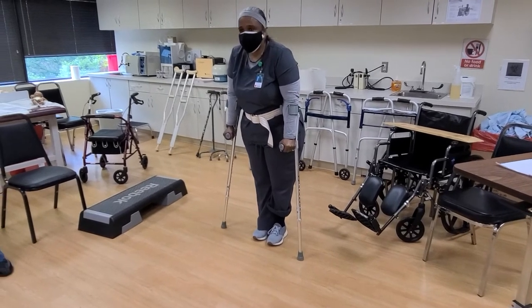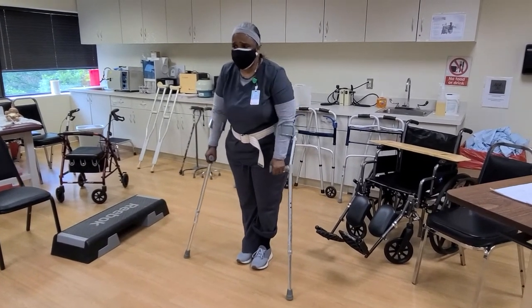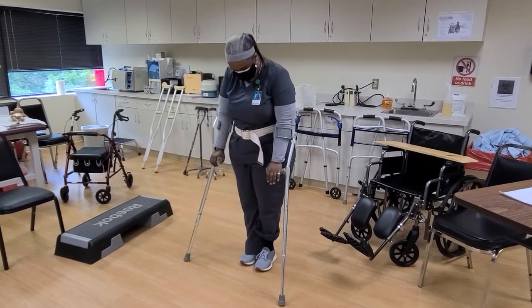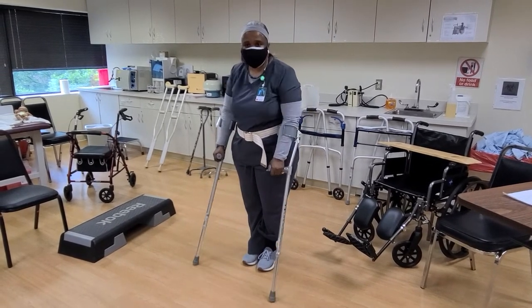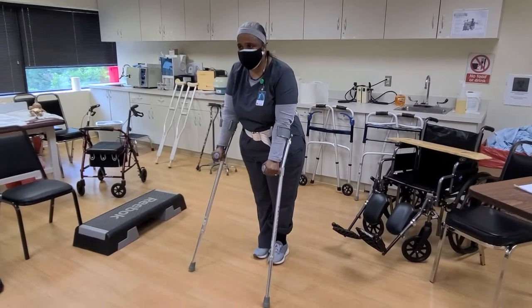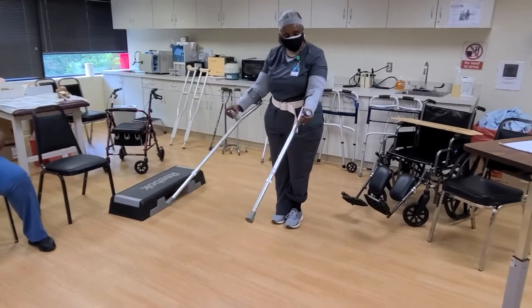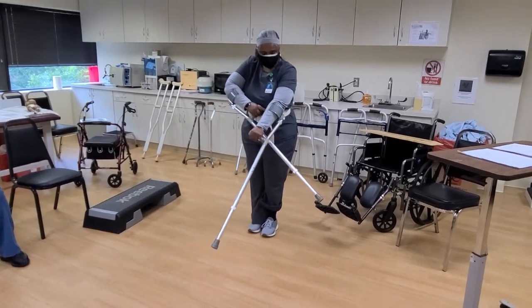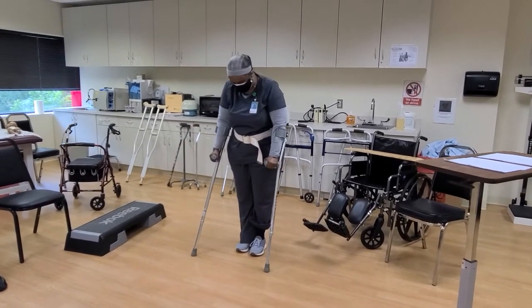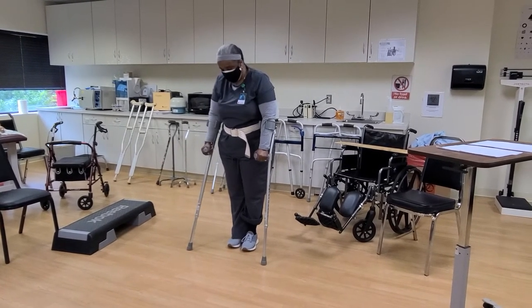This is for someone who is paralyzed from the waist down. What you're going to do is bring your Lofstrand Canadian forearm crutch out — because you're dealing with the forearm, not the arm, and that's really what gives you the balance and stability to use the crutches.